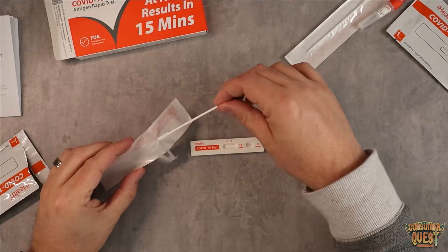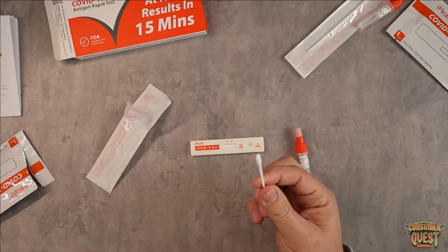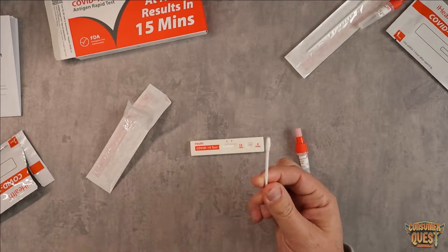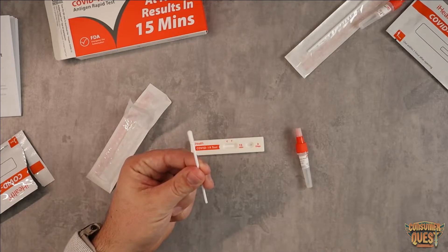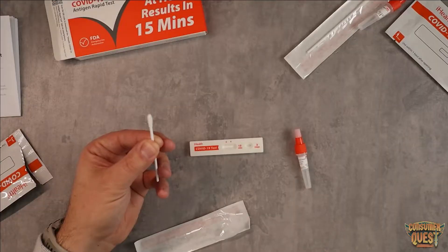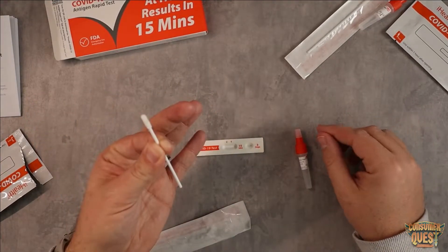We're going to go ahead and take the swab out and I'm going to do my swabbing in my nose. I like to do 15 seconds on each side. Let me do that really quick and get this thing all ready so I can show you the next step. All right, so I've got the swab and it's all ready to go as you guys saw.